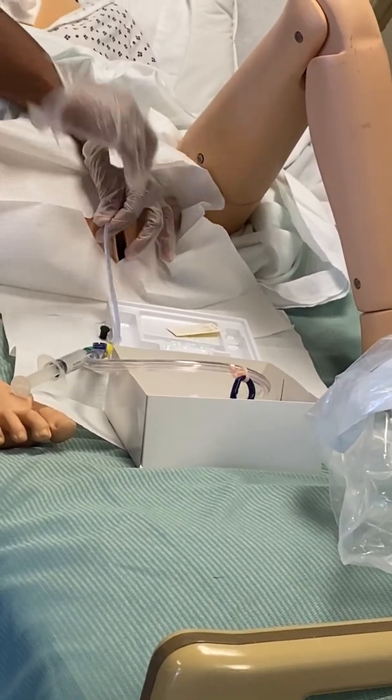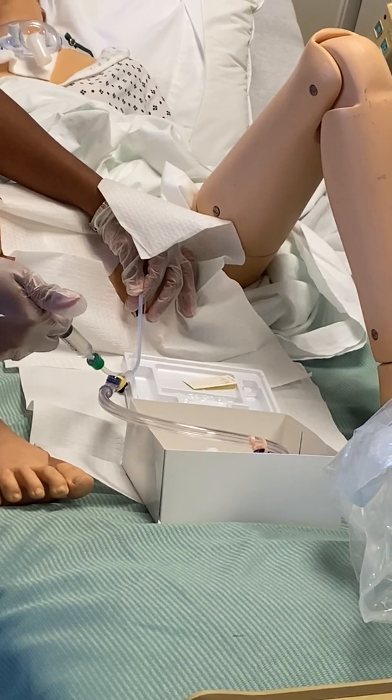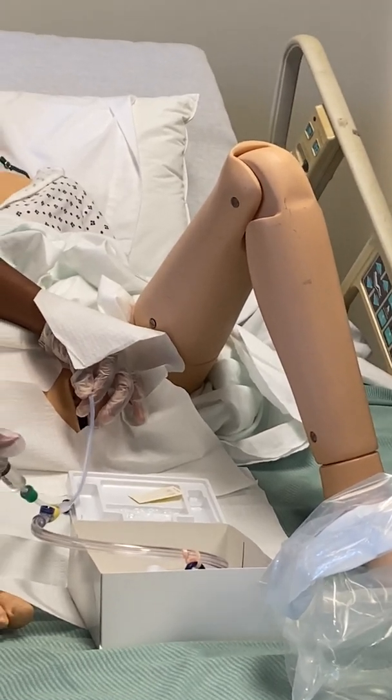And then I'm going to hold it there. That means it's in. So now I'm going to inflate my bulb 5 ml like it told me. And guess what? That means I know it's in place. I'm going to try to tug on it. It ain't moving, so that means it's in there.